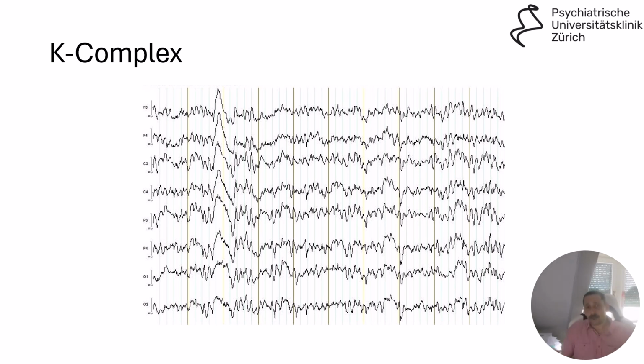And then we get to the complexes, and here we have the K complex. Maybe it's called that because of knocking. So if you are drowsy and you hear a knock, then you have this K complex. However, it's a development out of the so-called vertex wave you're going to see later, which is also similar but less high in amplitude. The K complex has a negative rise, then a positive deflection, and then after this some fast spindling component, which is this.